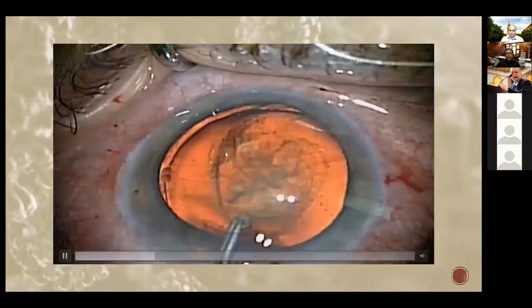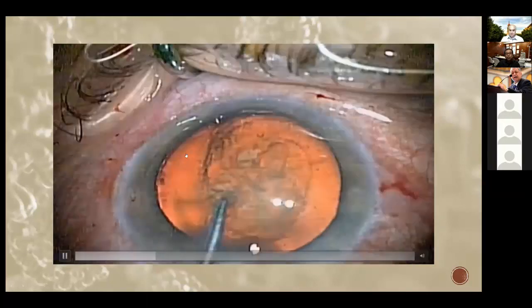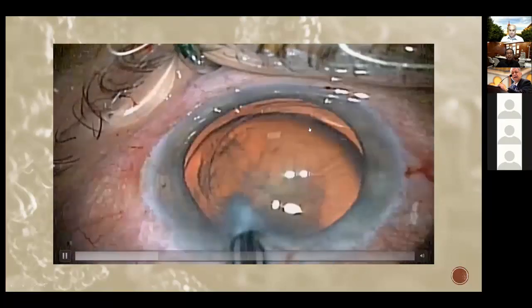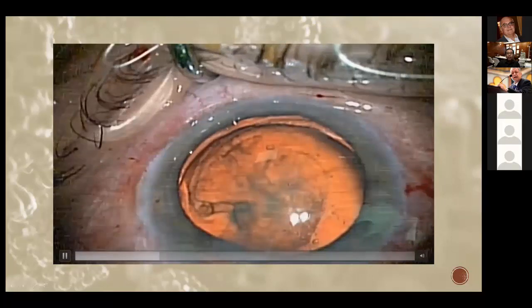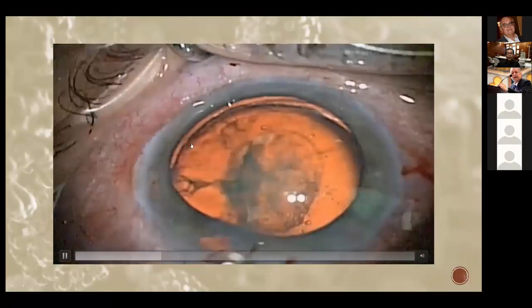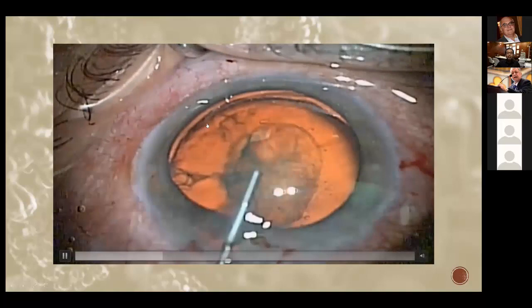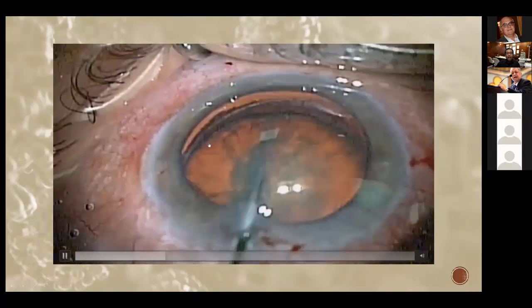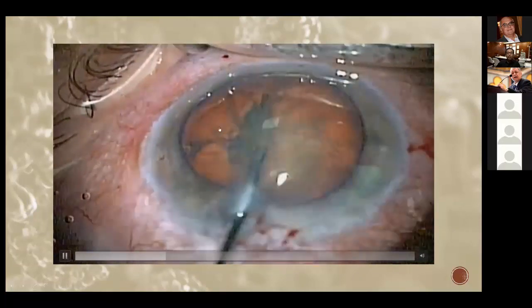As you can see here, it's catching more cortical material. So when you release it here, now you have this sign here, but you don't have the same sign on this side. So you can expect at the end of the surgery, during the irrigation aspiration, you're going to have problems here, and you're not going to have problems on the other side.